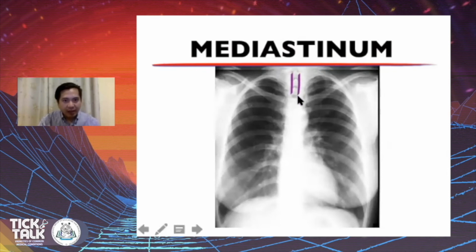The heart is also midline, but the left ventricle projects to the left. The apex of the heart should be found along the midclavicular line, so we can use this to see if the heart is displaced. And finally, the hila. We can see the pulmonary artery in this area, particularly the right descending pulmonary artery. Always take note that the left hilum is usually higher than the right.